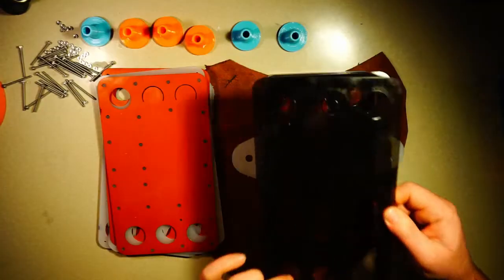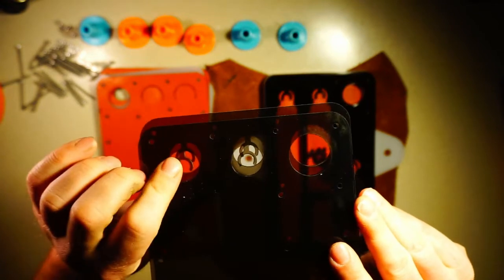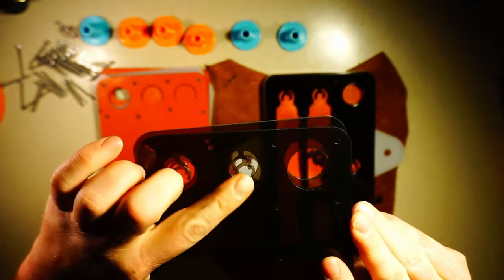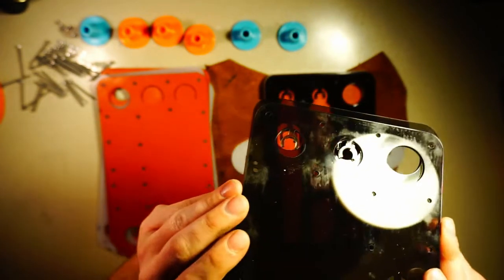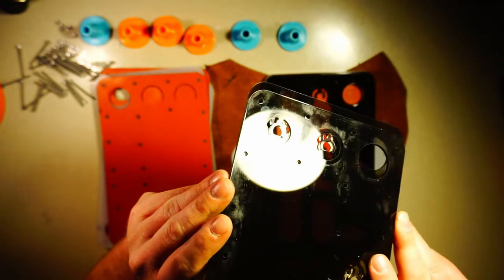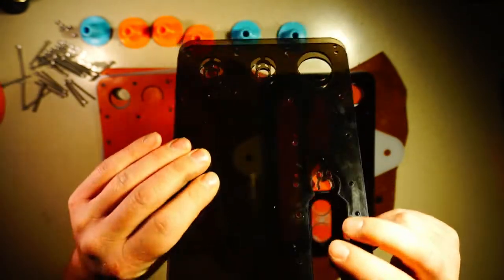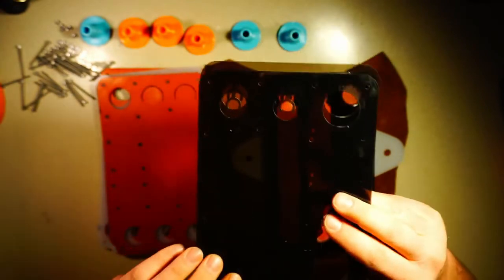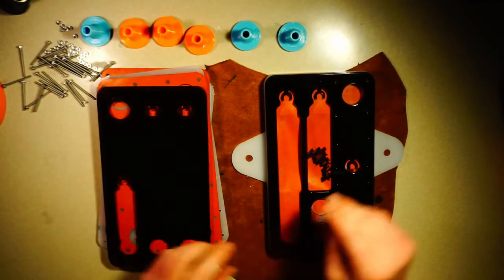Okay, so that's how those valves work. So in this plate, we have the two ports for the overpressure and the PEEP ports. These are the backing for the, let's see if we can see, the backing for the check valves here. And then here we have another channel and check valve.